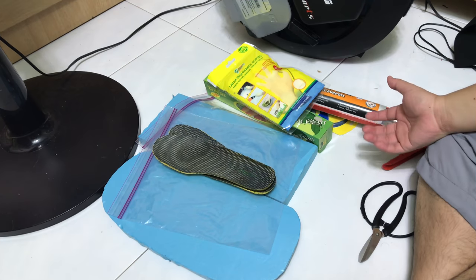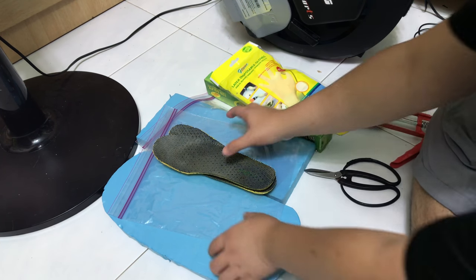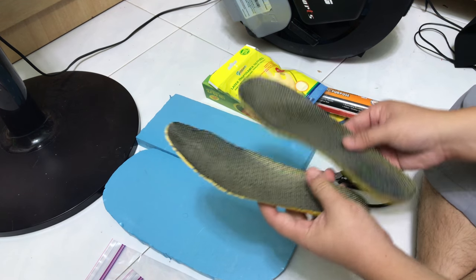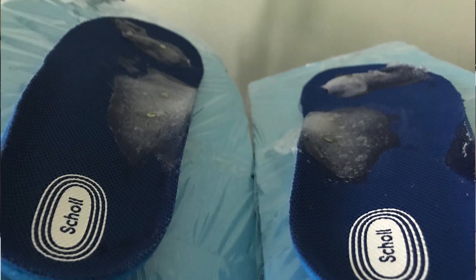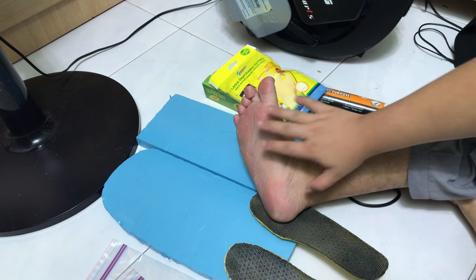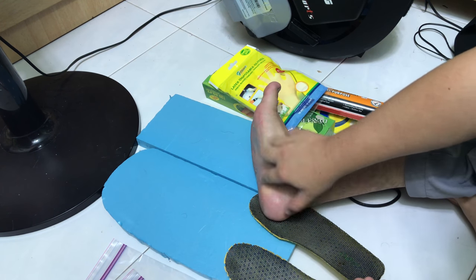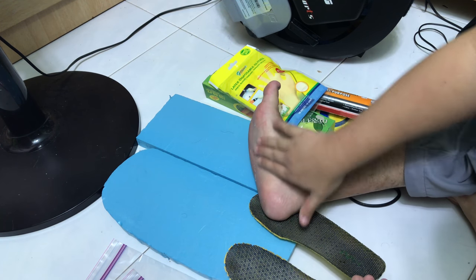Hey guys, welcome to another video for simonsvideo.com. My name is Simon Day and today I'm going to do a DIY custom orthotic insole with a proper gel onto the legs so that flat foot people or high arch people will have some support at the arches.